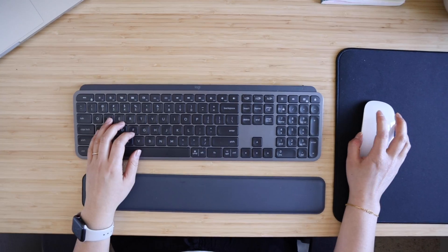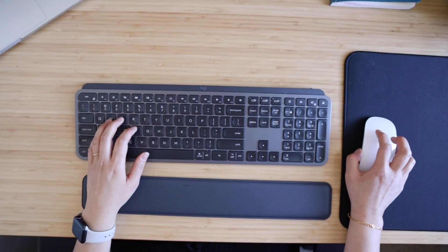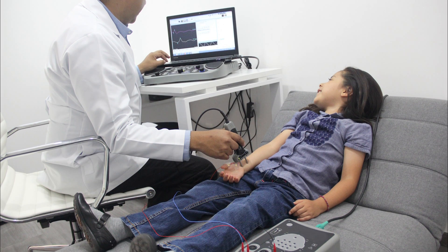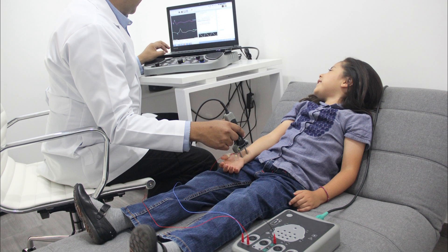But there are all kinds of situations where you'd need way more detail about which muscles you're contracting. Maybe you're a physical therapist designing a new exercise and want a more nuanced idea of which muscles it works. Or maybe you want to study something more precise, like how a mouse will affect someone's wrist muscles. And that's where electromyography comes in, or EMG — a technology that uses the electrical activity of muscles to tell us what muscles are activated at any given time.